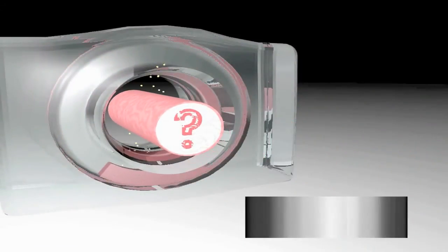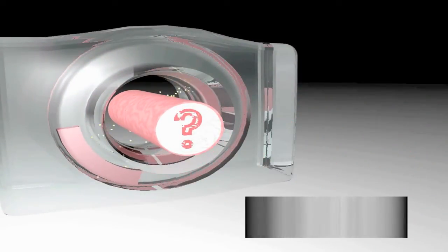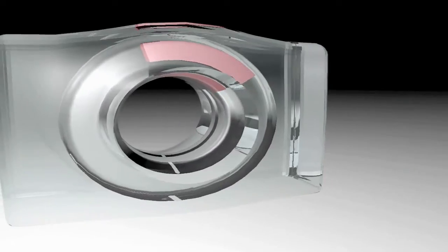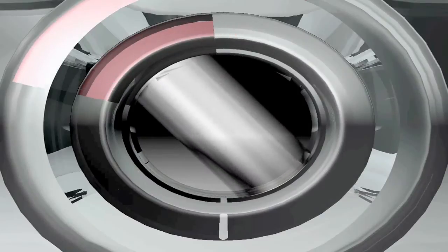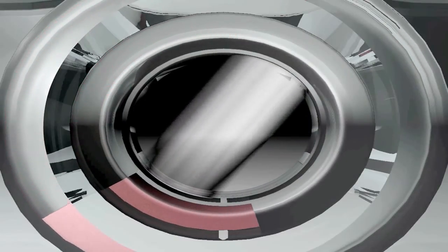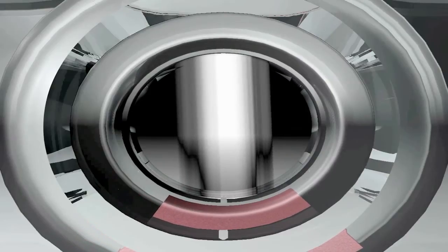So we're taking lots of X-rays now as the scanner rotates, and we've got to figure out who this celebrity is from these X-rays. Well, since we got them by squishing all the information in the stick of rock together, let's unsquish them. Let's beam them back as if they were beams of light, in the direction in which they were taken. And hopefully where those beams cross, that will give us information about the structure inside our scanner.